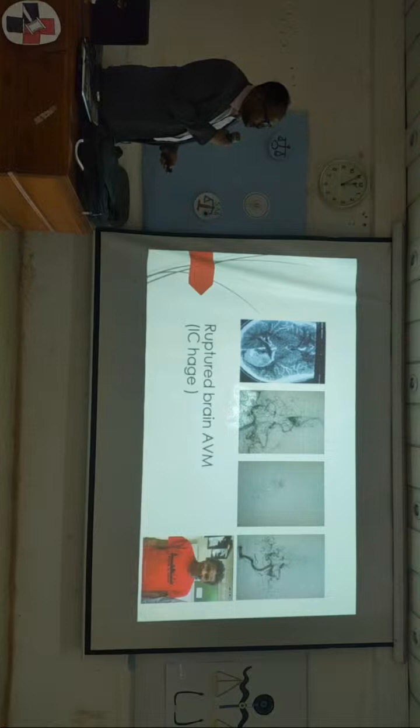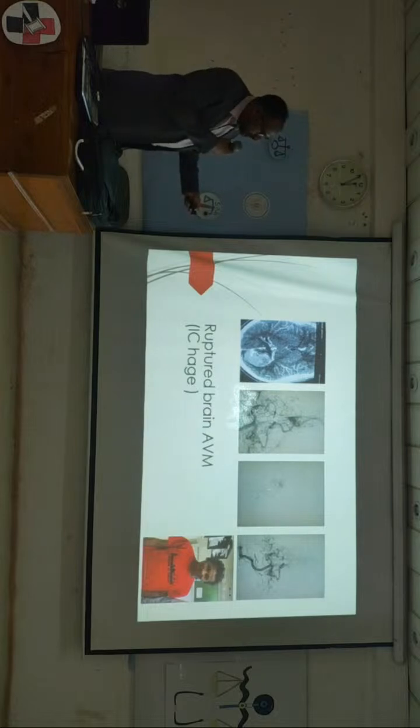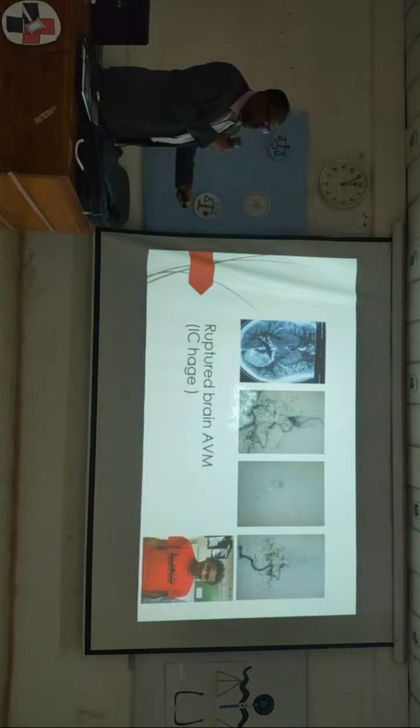Here we treat such a condition also using minimally invasive procedures. We go through the common femoral artery, the basilar artery, through the vertebral arteries, using a microcatheter. Using the microcatheter, we reach this connection, the connection between the artery and vein, and then we deliver embolizing material, liquid embolizing material like Onyx, to cut off the connection between the vein and the artery in this area.